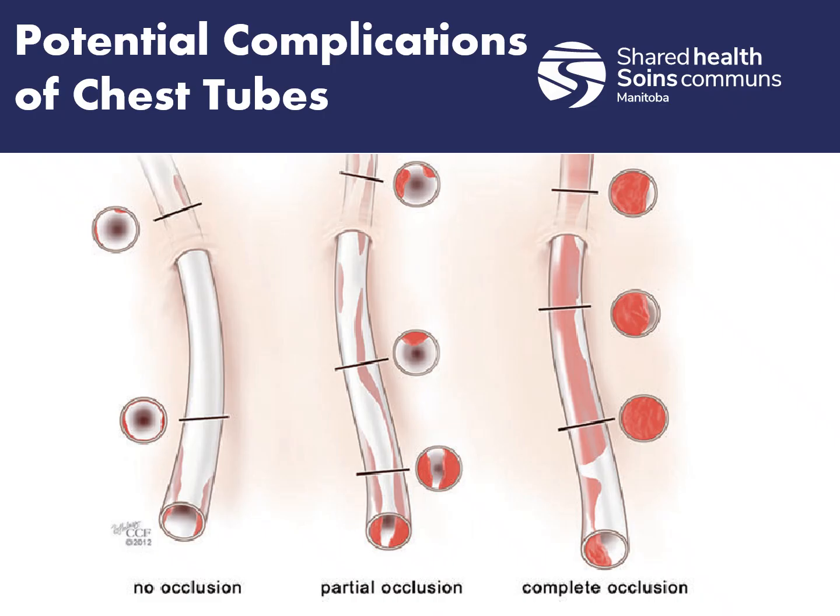If there is a lot of buildup inside the tube, some people may do what they call milking it. We don't want to milk the tube. That's definitely not our practice. Basically, somebody might take the chest tube with their thumb and forefinger or their hand, and then pull down on the tubing to try and squeeze all that blood or the clots out of the tube. They may try to twist it or knead it to break up the clots and move them out. We don't do that.